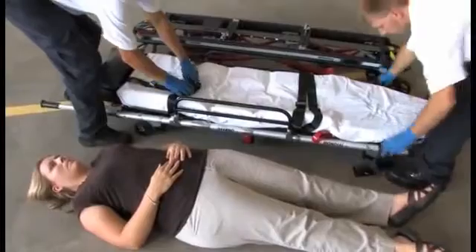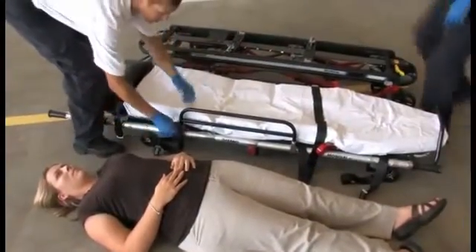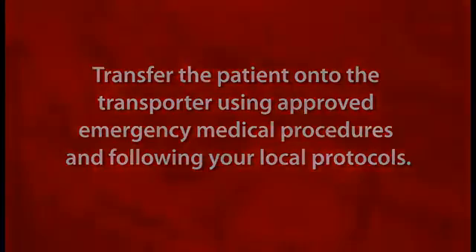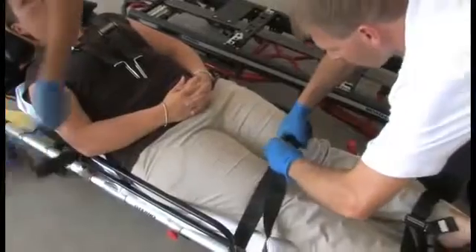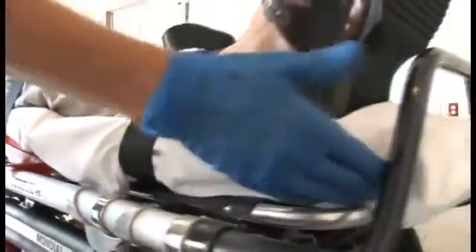Unfasten the restraints and lay them to the side of the bed surface. Then lower or fold the side arms down. Transfer the patient onto the transporter using approved emergency medical procedures and following your local protocols. Now raise the side arms, adjust the backrest and shock frame as needed, and fasten and adjust the patient restraints. Be sure that sheets and other articles are positioned where they will not interfere with the operation of the transporter.